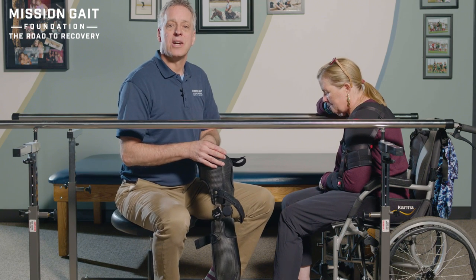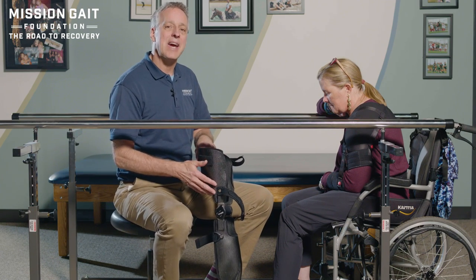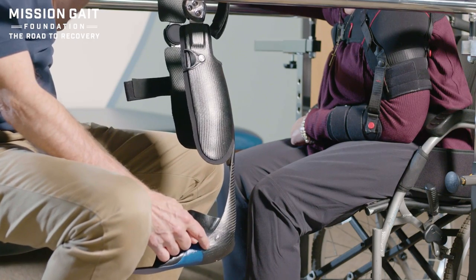Hi, I'm David Lawrence, founder and CEO of the Mission Gait Foundation. Today, we're talking about fitting a KAFO to the individual. KAFO is knee, ankle, foot, orthoses.